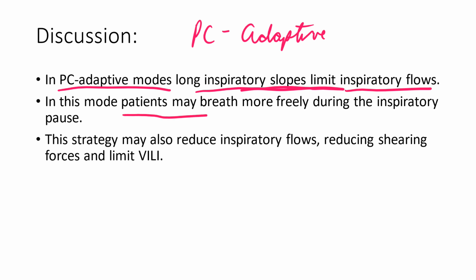The nice thing about PC adaptive is that the patient is allowed to breathe at any time. So the ventilator dyssynchrony with the patient is reduced. And we can still use this mode to reduce inspiratory flows. We can reduce the shearing forces potentially and limit ventilator-induced lung injury by limiting those peak inspiratory flows. And that's a suggestion that we should be considering studying.